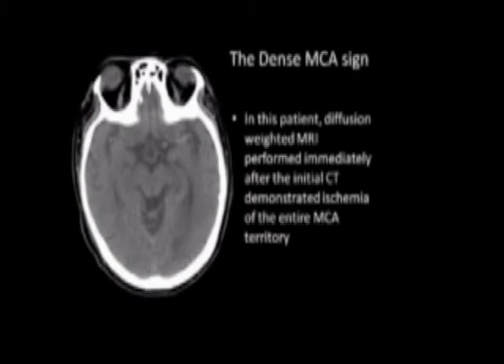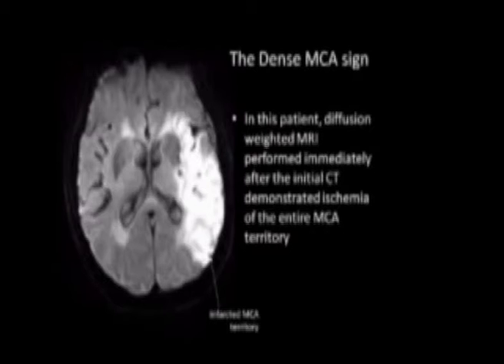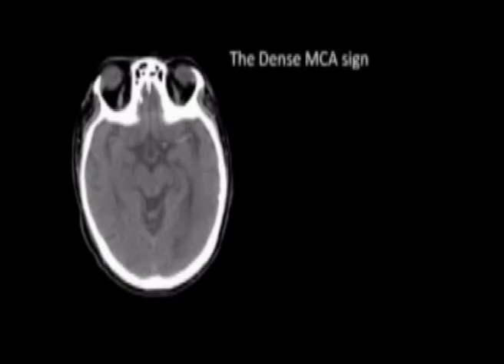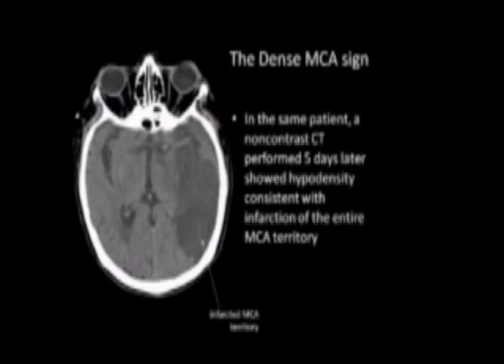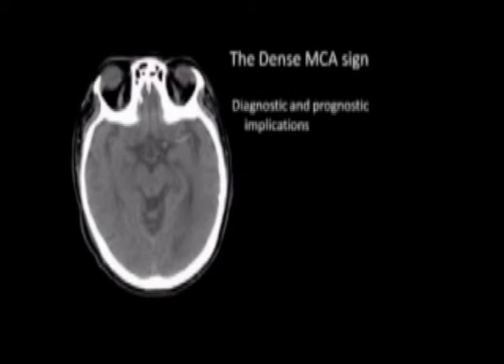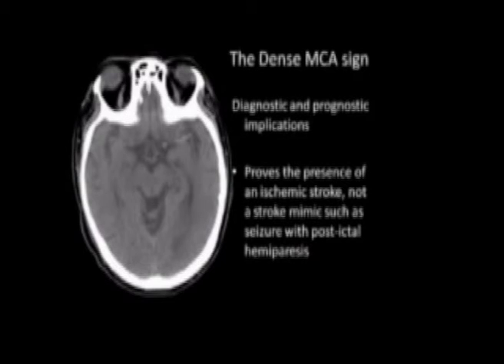In this patient, diffusion-weighted MRI performed immediately after the initial CT demonstrated ischemia of the entire MCA territory. In the same patient, a non-contrast CT performed five days later showed hypodensity consistent with infarction of the entire MCA territory. The dense MCA sign has important diagnostic and prognostic implications — it proves the presence of an ischemic stroke, not a stroke mimic such as seizure with postictal hemiparesis.